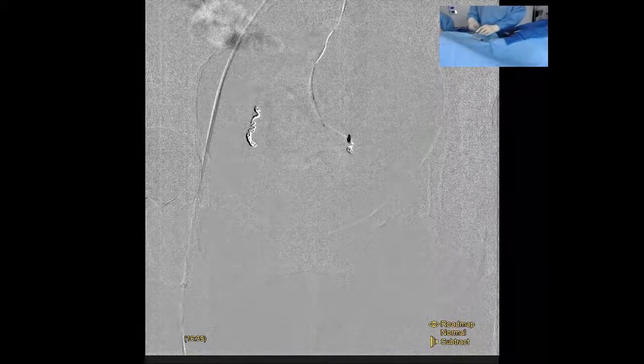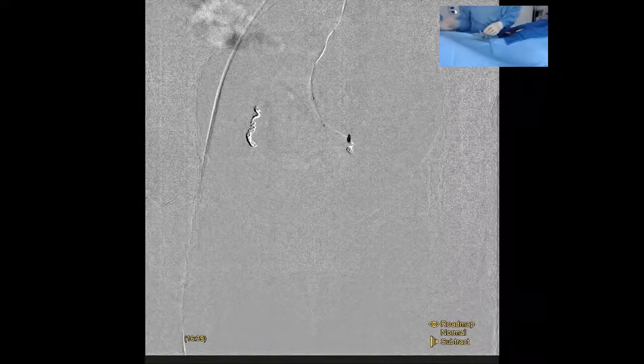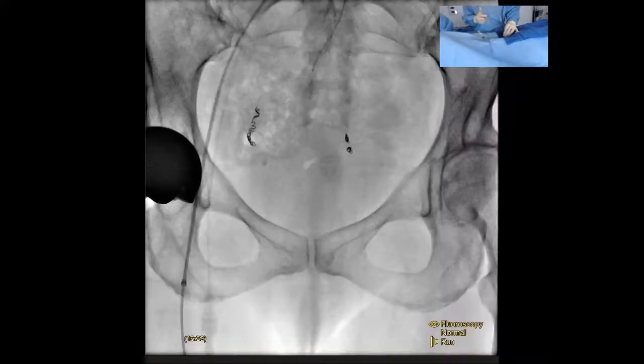Okay. So then a technical question for you. If you had the normal, most typical anatomy that you see, where there are anterior and posterior arteries on both the right and the left, do you use an oblique to catheterize those, because they tend to overlay on top of each other in the view? I would say personally, I prefer to do everything in this projection if I can. It allows you to not have to move the C-arm so many times. So that's nice.